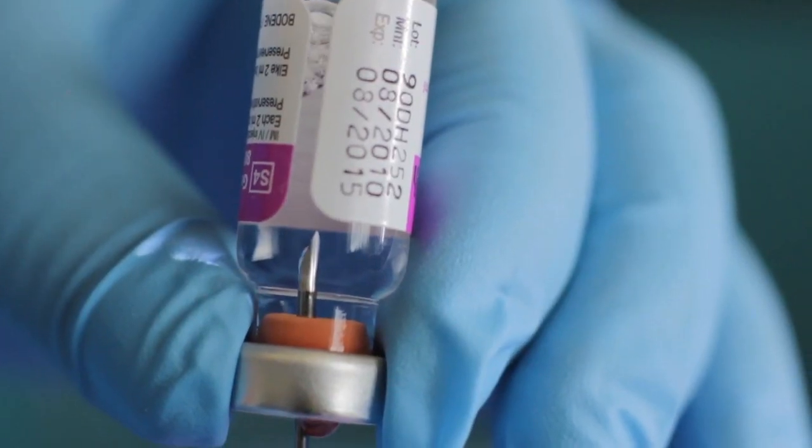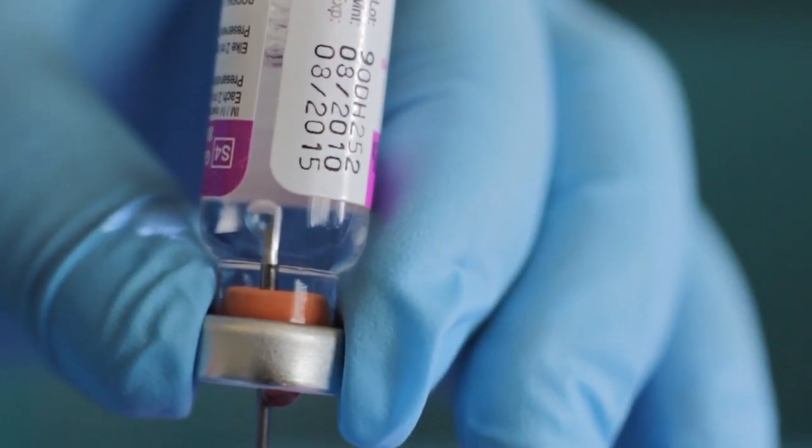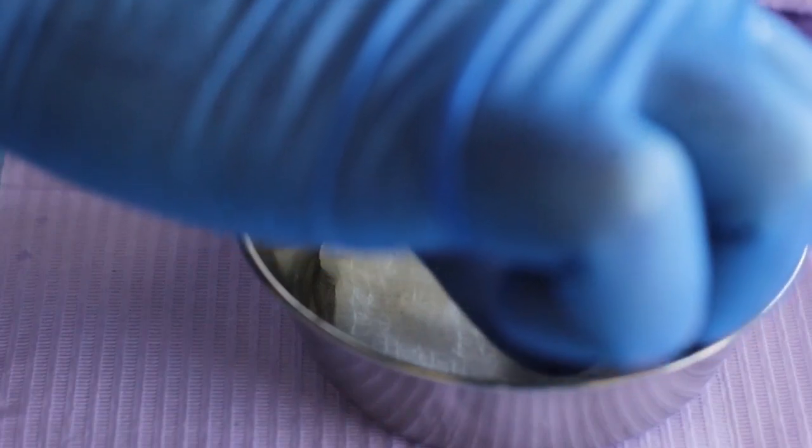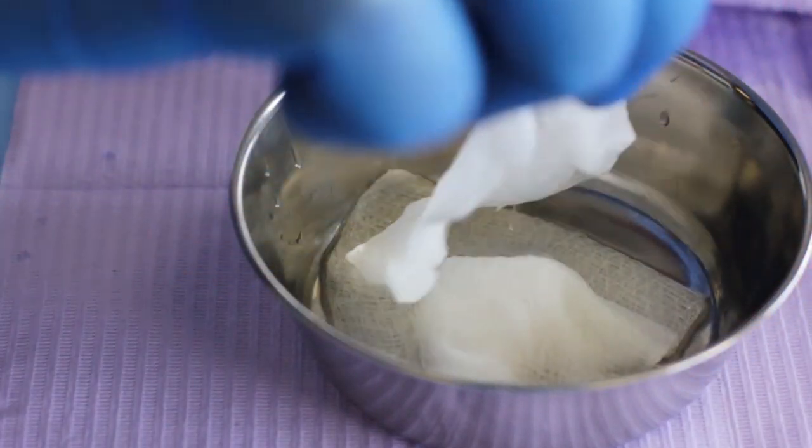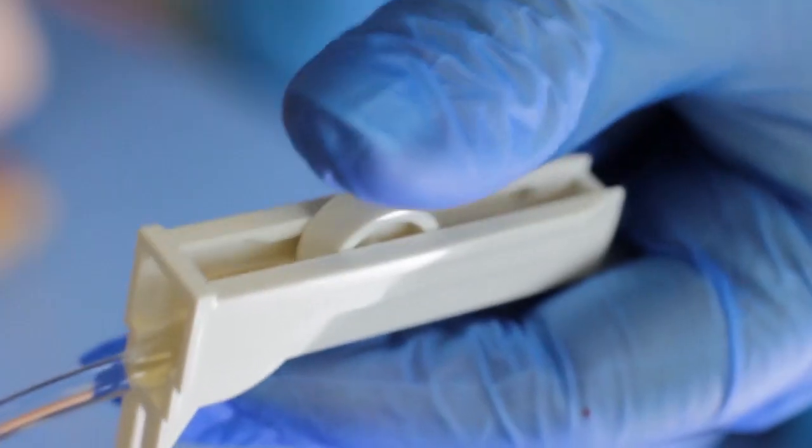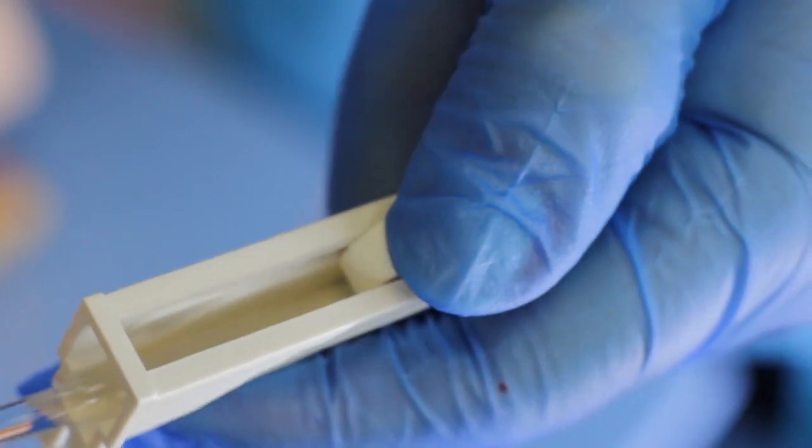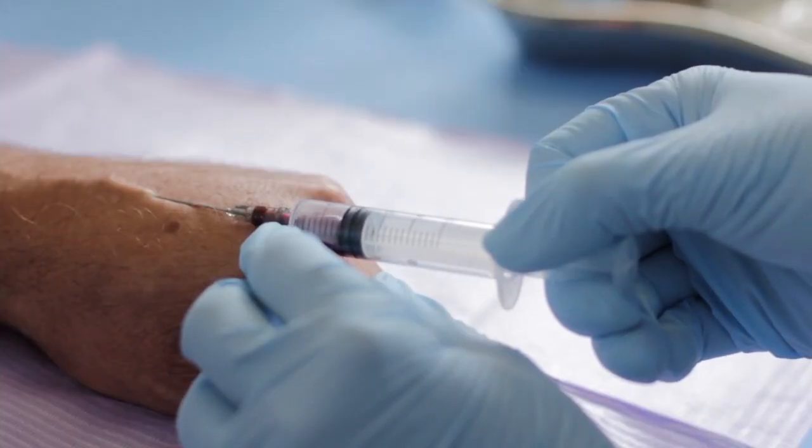Since these gloves are exposed to the environment, there may be non-pathogenic bacteria on them. Surgically clean gloves are perfect for examining patients, doing general nursing tasks like changing dressings, and performing routine phlebotomy procedures.